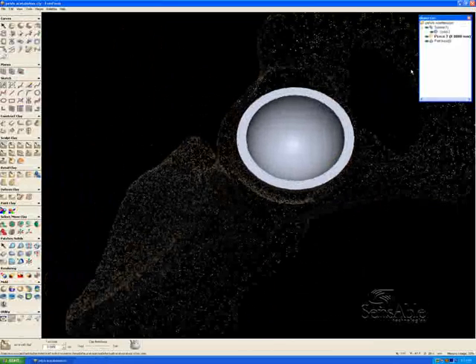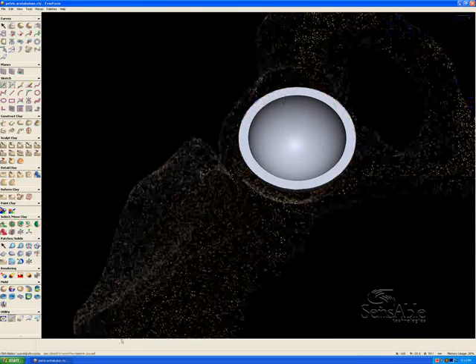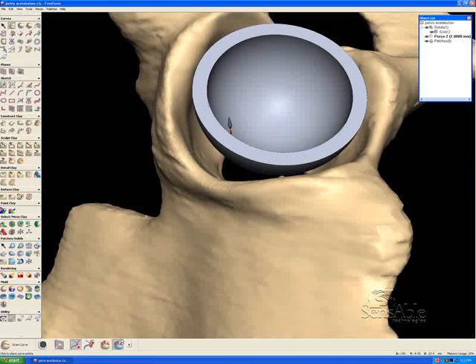I'm going to go ahead and show you a workflow that involves half a dozen tools or so in Modeling Plus, and the first one is going to be a curve drawing tool. So I have this pen stylus here, and I can physically go in with the Phantom desktop device, and I'm physically touching this cup here, and I can rock around on the inside of it. I can also feel the clay of the pelvis as well.